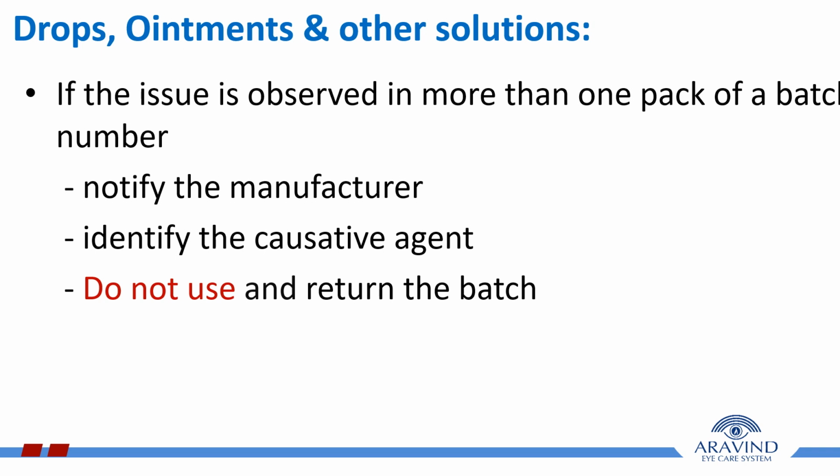If the issue is observed in more than one pack of the same batch number, do not use that particular batch. Then identify the causative agent, immediately notify the manufacturer and then return it to the supplier.